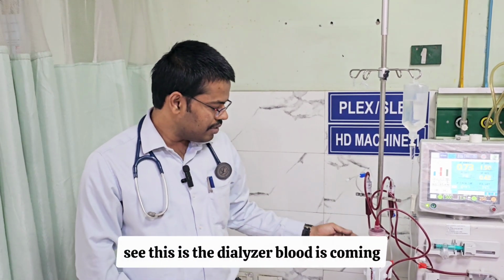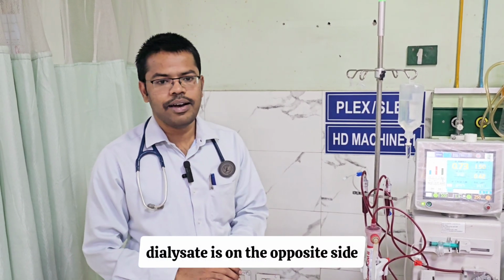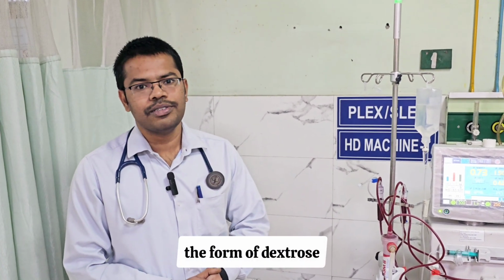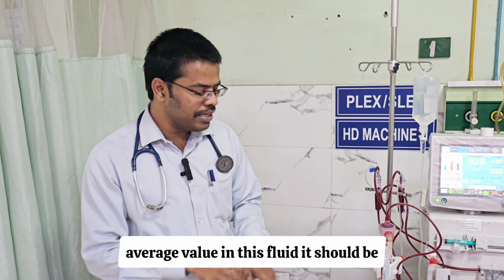You can see this is the dialyzer, blood is coming, dialysate is on the opposite side. The dialysate ideally contains glucose in the form of dextrose. How much does it contain? 100 to 200 milligram per deciliter is the average value in this fluid.